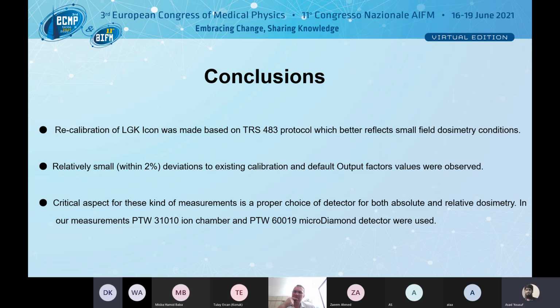About the Gamma Knife or CyberKnife, how do you calibrate basically? I just want to understand the procedure. Our chamber is calibrated against the Cobalt 60 NDW factor. Yes, it's the same here. In Czech Republic, every 2 years we have to go to a calibration laboratory.